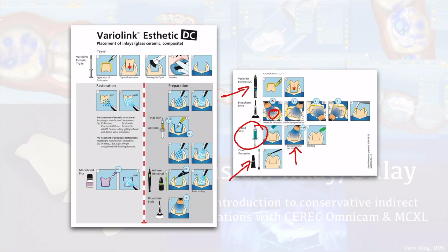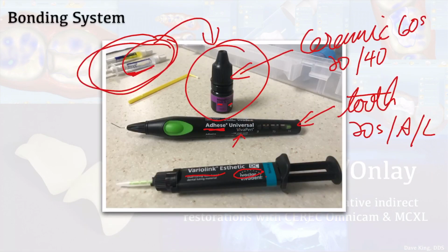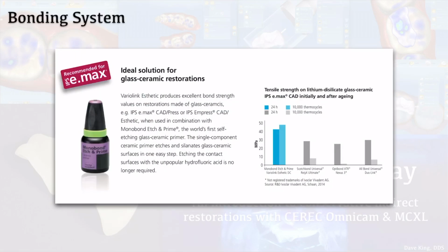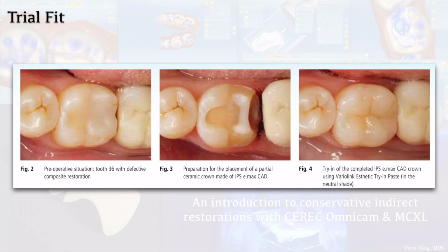But usually delivery, once you've etched it, and cleanup with etch and prime, with this solution here, delivery and cleanup takes me 5 minutes. So, here's the materials. Here's the adhese. Here's the etch and prime that I was mentioning. You can look all this stuff up online. Monobond etch and prime, much higher bond strengths than all these. It's a great material, good stuff. In the end, my personal experience is this stuff works really well. But like I said before, what works well in your hands for your patients, what works best for you is perfectly fine as long as it's a good long-term solution.